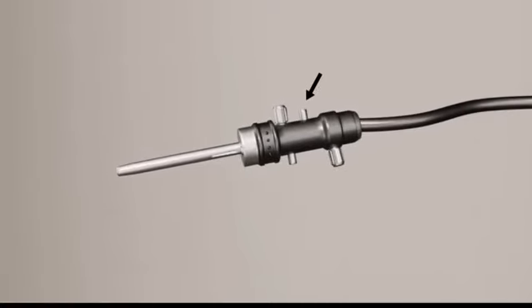Gas tube connector. An insufflation system which provides continuous insufflation at a preset, limited low insufflation gas pressure and a high insufflation gas flow, thereby avoiding the necessity of measuring the intra-abdominal pressure while ensuring that a determined pre-adjustable maximum insufflation gas pressure cannot be exceeded. The system comprises a gas delivery line having an inlet end coupled to a source of insufflation gas and an outlet end for connecting to the gas inlet of a surgical laser-equipped endoscope.